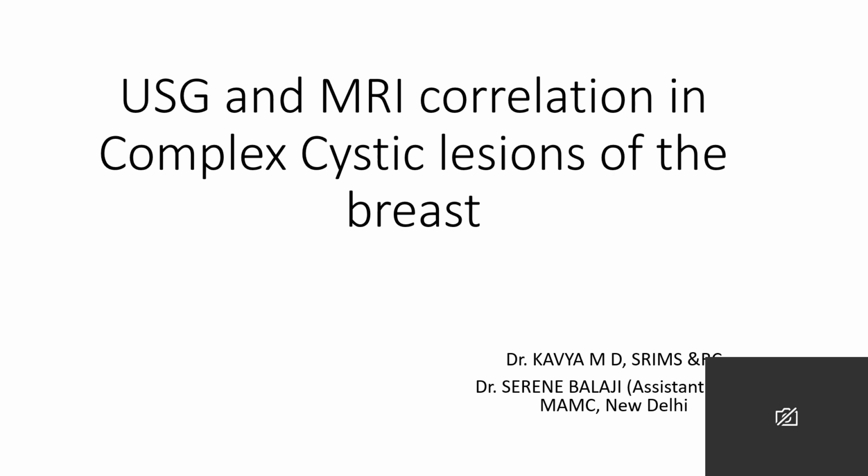Myself, Dr. Kavya from Srinivas Institute of Medical Science and Research Center, Mukka, Mangalore. My co-author is Dr. Serene Balaji, Assistant Professor from MAMC, New Delhi. My topic is ultrasound and MRI correlation in cases of complex cystic lesions of the breast.